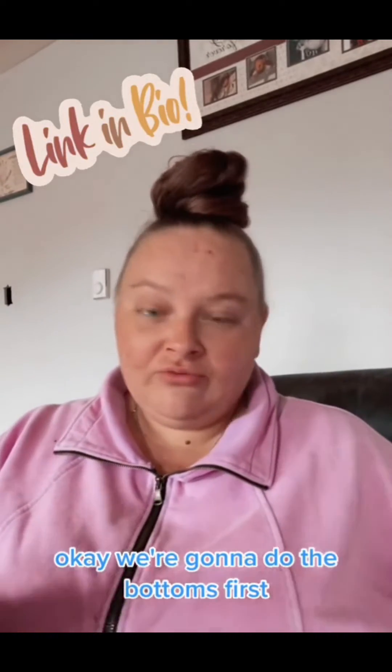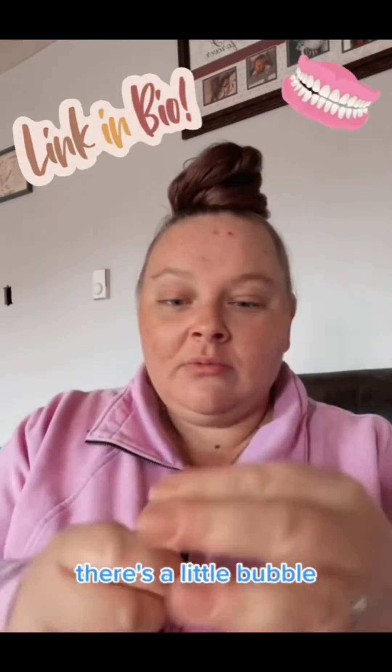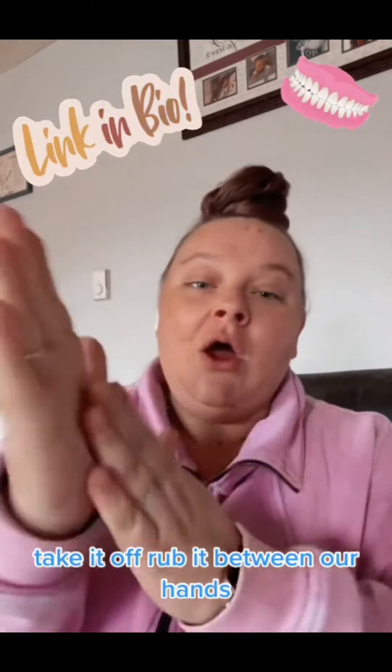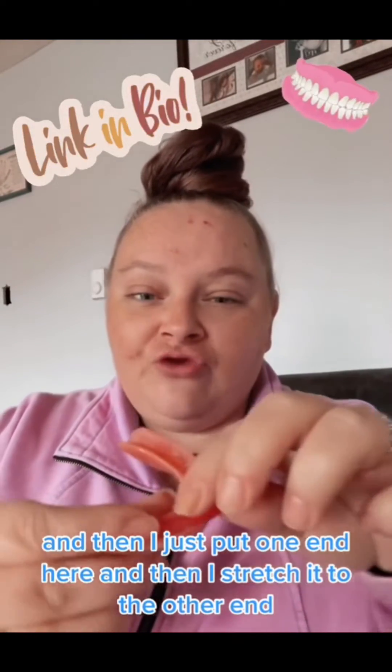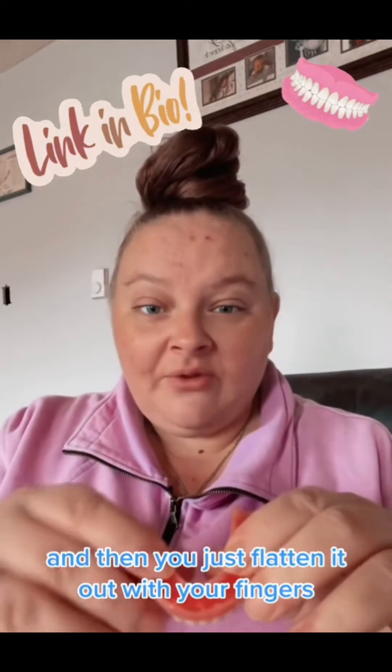Okay, we're going to do the bottoms first. That's usually what I do. Make sure you are always holding it by the bottom. It's about a pea-sized amount. Take it off, rub it between our hands. And then I just put one end here and then I stretch it to the other end. And then you just flatten it out with your fingers.